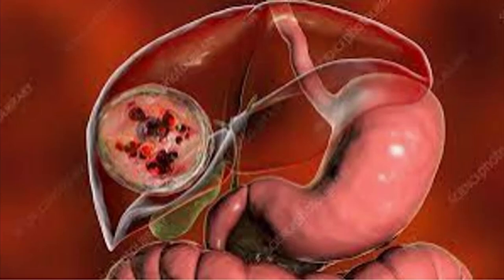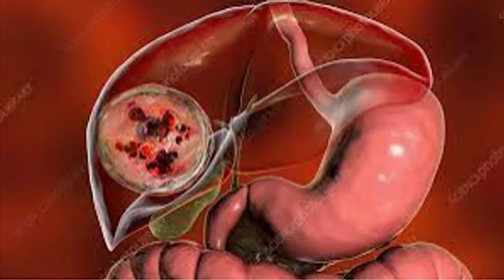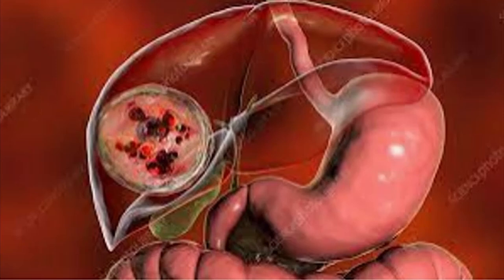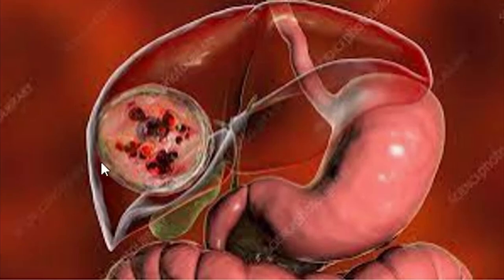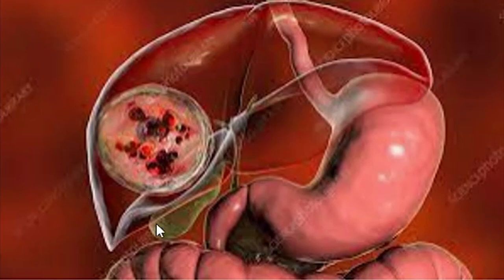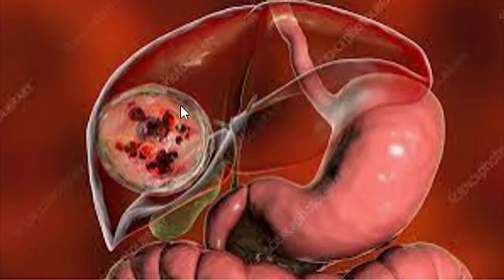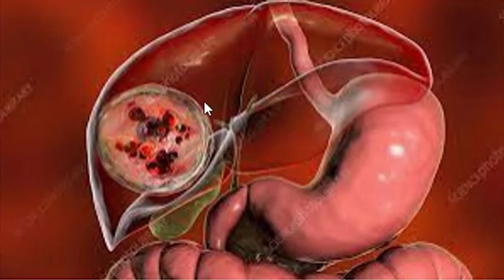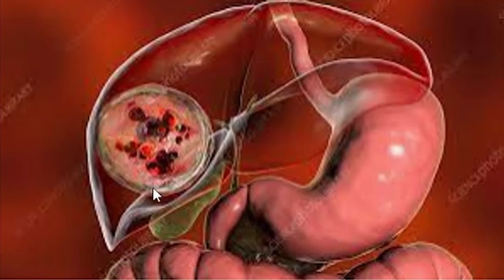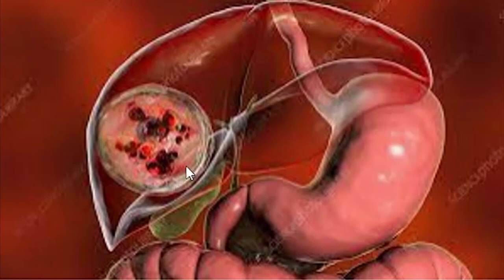In brief, I am going to show you how a hydatid disease or cystic echinococcus presents in general, and then I will show you how it presents sonographically. You can see here — this is our liver, and there is this lesion. This is a typical example of a cystic echinococcus or a hydatid cyst. I am going to delve more on this type of cyst and show how it appears sonographically.